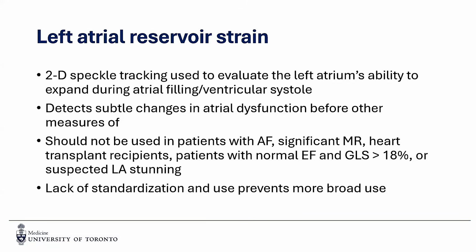And it's also less useful in people with normal ejection fraction. This took a little bit of a while for me to understand, but in general, a lot of the left atrial reservoir strain is actually because of the ventricular contraction. So if we have somebody with a preserved ejection fraction, the ventricular contraction is still preserved, so you can still strain and stress the left atrium.